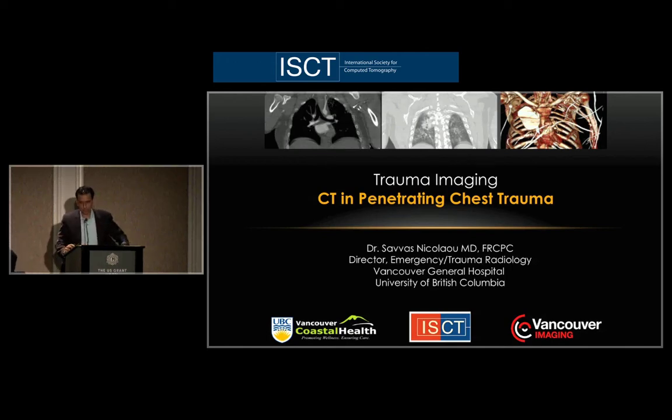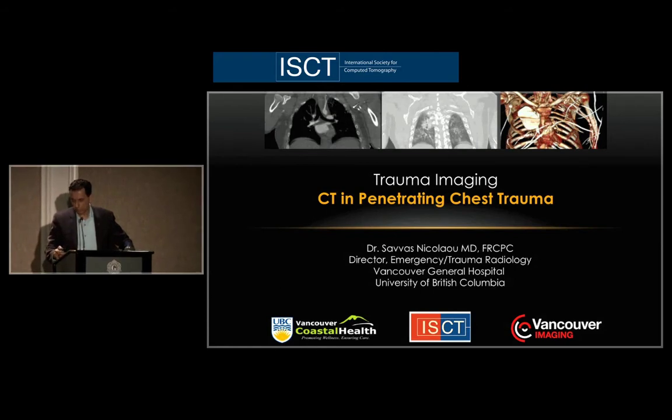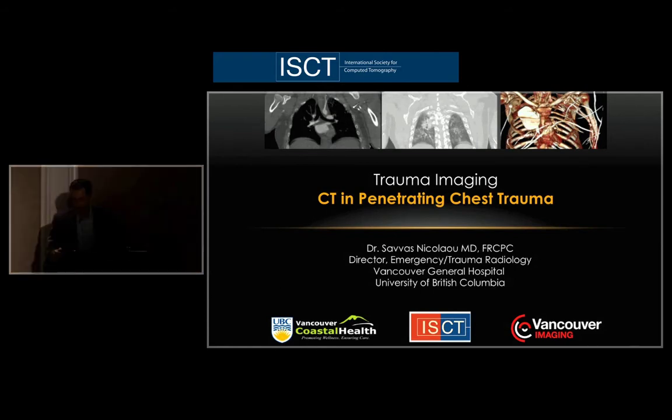So my next topic will be trauma imaging in penetrating thoracic trauma, the role of CT.